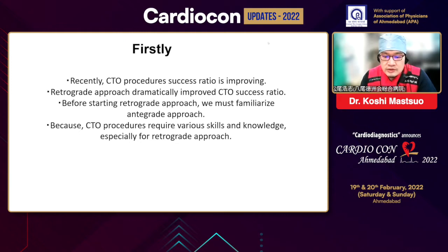During retrograde approach for externalization, you must advance the wire antegradely. It means antegrade preparation is necessary for the retrograde approach. So we must familiarize ourselves with antegrade approach techniques.